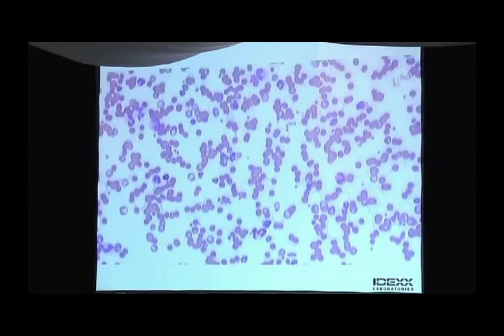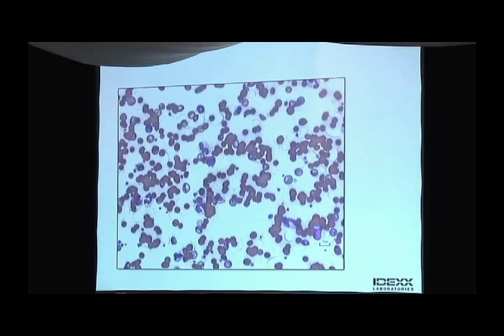run through a few where they are probably more than 30, depending upon who's looking at them, they will say more than 30 or more than 50 red cells. So we see a few of those, okay? And you have them in here.